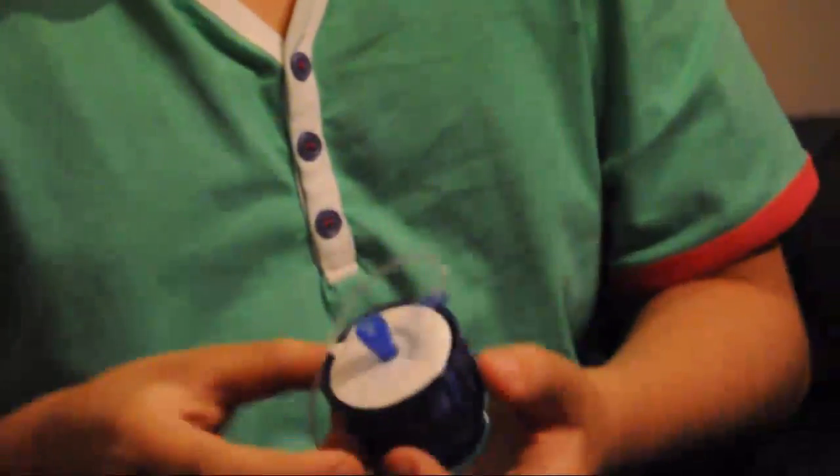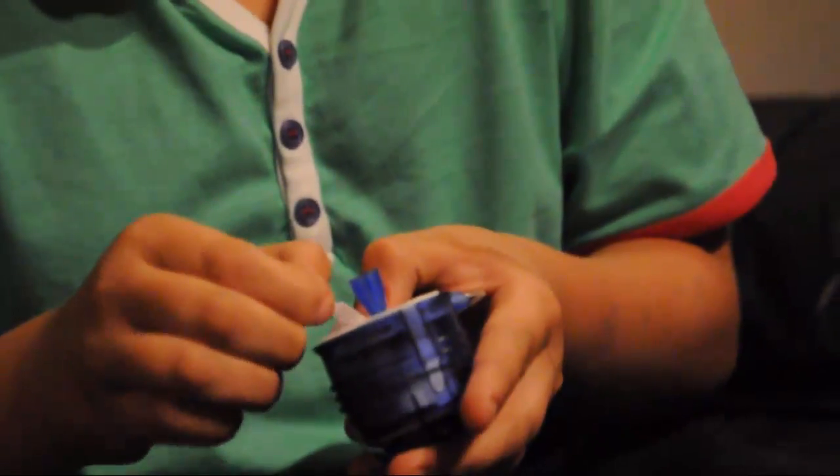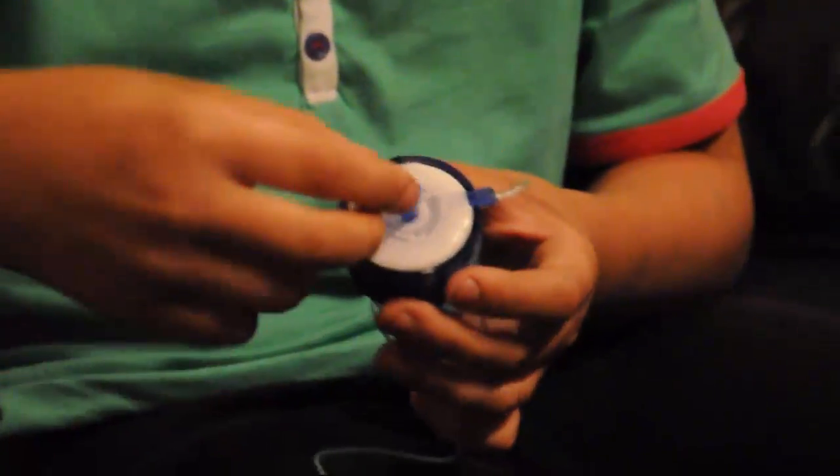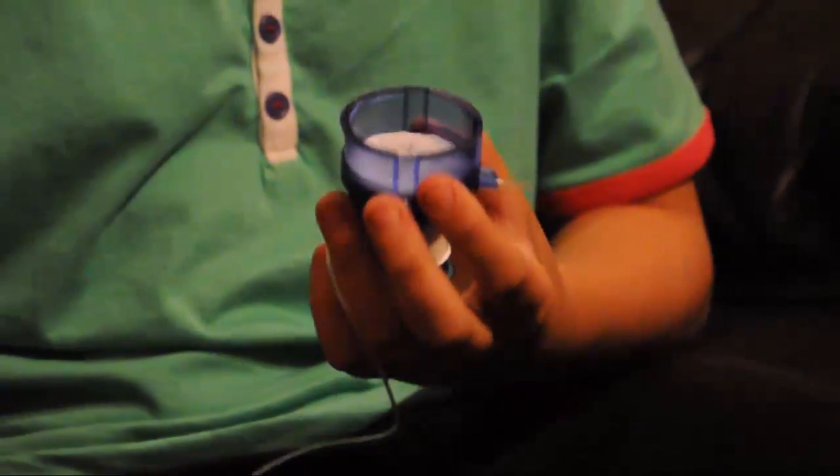And then you need to just turn it round and just gently grip the end, try not to touch it so that it stays sticky, and pull the last one off. Then you just grab the blue bit. The blue bit has the needle inside, so it's protecting it. You grab the blue bit and then just push down until you hear it click. Then you just twist the blue bit, pull it off, and then just leave it to the side.